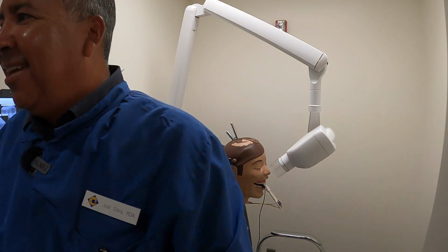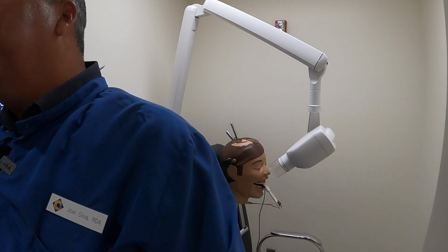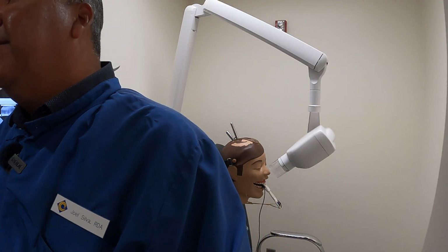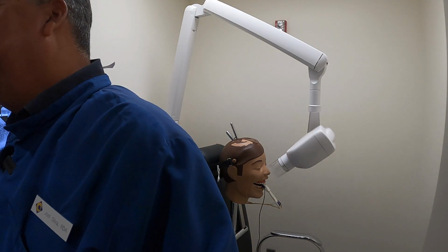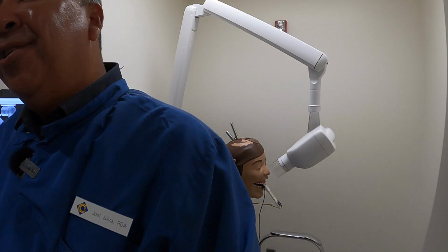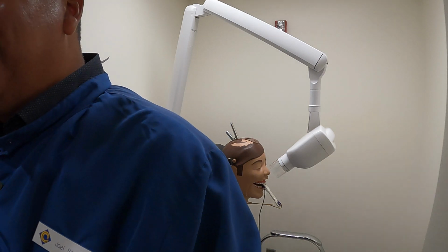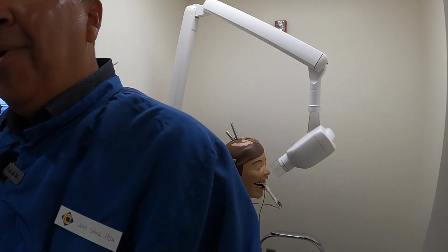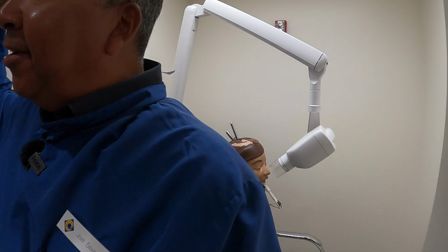What determines if it's positive or negative? I talked about this whole thing. I talked about the beach. I went to the beach. Is that ringing the bell? I said that if you went to the beach and then you put your toes in the sand and walked right up to the water, that was 0 degrees. And then I said if you went under the water, that was negative. And then if you decided to turn around and go up to Big Bear, now you're up at positive degrees.